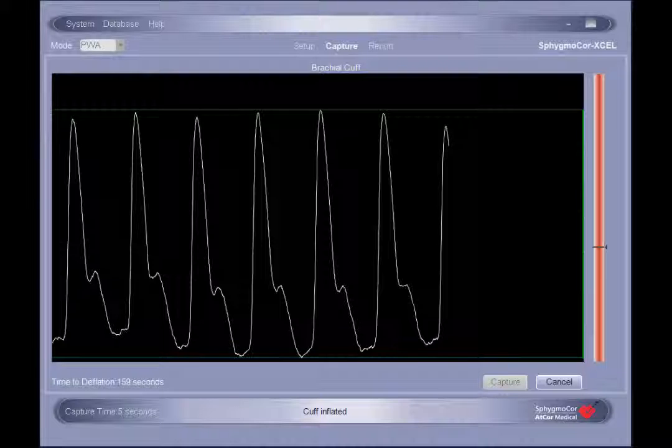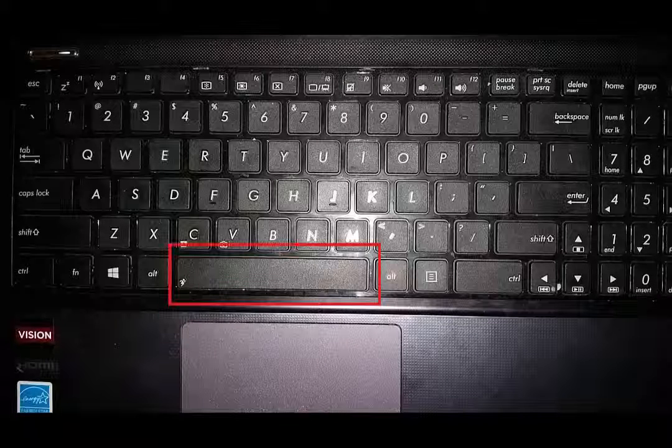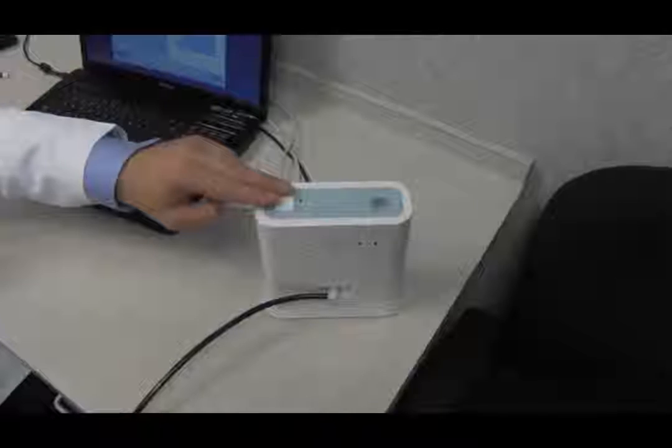However, some circumstances may require the operator to manually capture the assessment. This can be accomplished at any time by pressing the space bar on the computer keyboard. The cuff can be deflated and the assessment ended at any time by clicking on Cancel in the capture screen or pressing the Stop button located on top of the module.